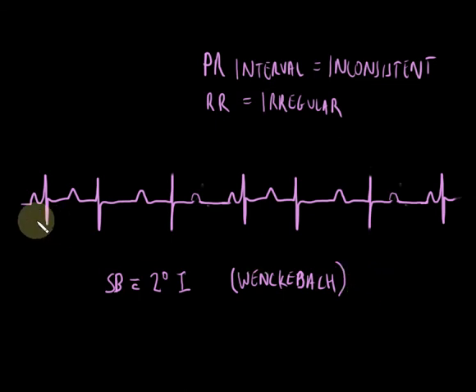The PR interval, though, is inconsistent. It doesn't take much to go here. This one's a real short PR interval. That's a super long PR interval. It's not even close.